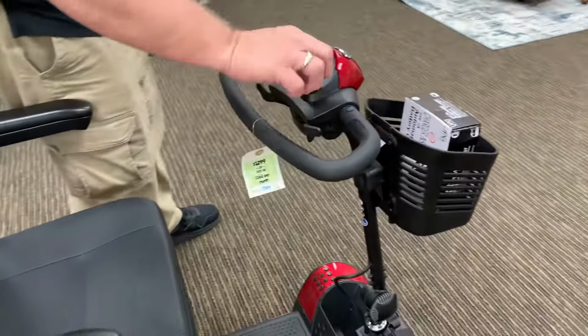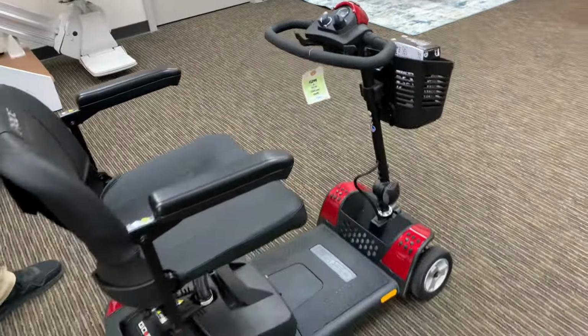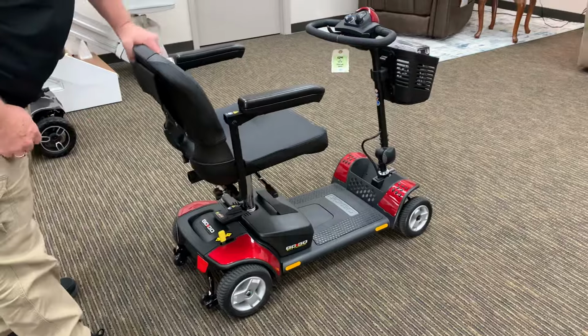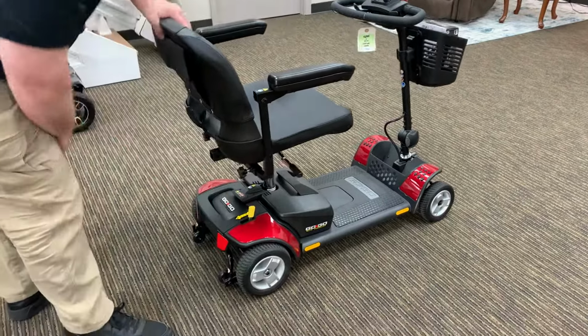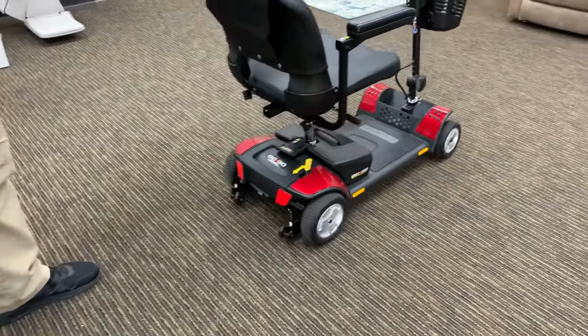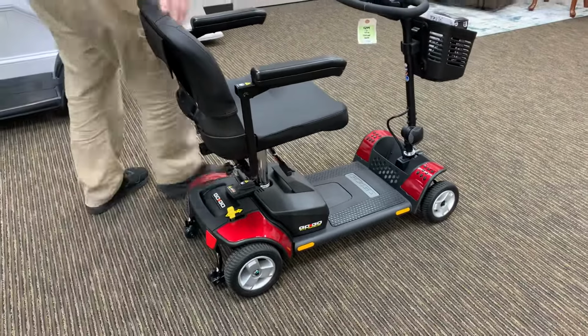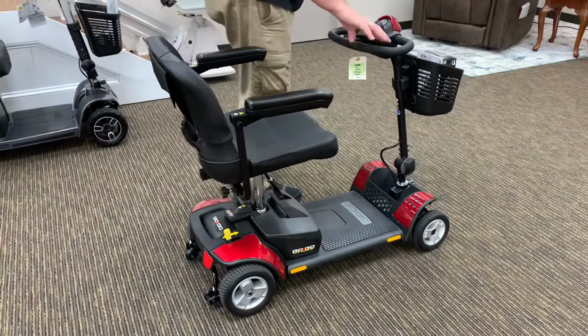Now, one more thing I'm going to show you. If you run out of power, run out of juice, you need to move it. The wheels are locked. This right here lets you unlock it where you can move it freely. But it has to be in the lock position to be turned on and operate properly.